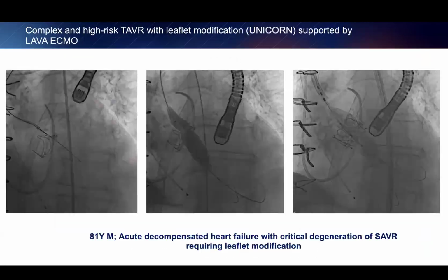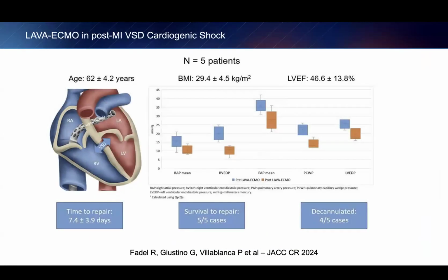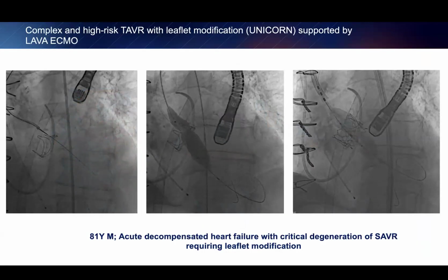Okay. What else? What else do you guys want to talk about? So I'm just thinking back on one of the patients that we had with really horrible RCA disease. I don't know if you remember, like Charlotte Healy, where we didn't have any means to support her RV. By the end of the case, she had developed fulminant pulmonary edema, and we just didn't have a way to vent the LV at the end of the case. Is there any sort of means to provide her RV support? What resources do we have?